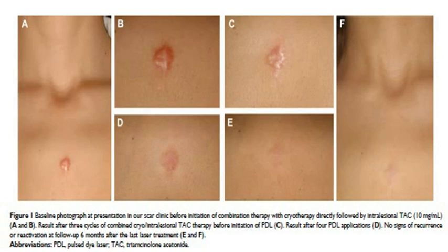Result after 4 PDL applications, D. No signs of recurrence or reactivation at follow-up 6 months after the last laser treatment, E and F. Abbreviations: PDL, pulsed dye laser; TAC, triamcinolone acetonide.